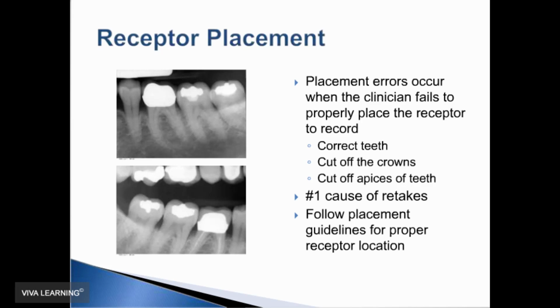For instance, on this periapical, if the bite block was resting on the second molar and no premolar included, the operator would have picked up all 3 molars on this view. If this was meant to be a premolar periapical, they have the receptor too close to the teeth, which is pushing the receptor posterior and off the horizontal for the premolars. So moving more to the midline and moving it forward would improve the projection if it were a premolar view.